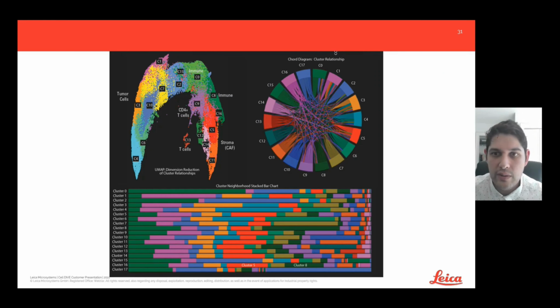This clustering data gives a clue as to why that might be. These desmoplastic cells in cluster 16 cluster often with clusters 5 and 8, and these represent smooth muscle actin positive stromal cells and CD45 immune cells, respectively. So what might be occurring in these tissues is that immune cells are getting bound up in collagen networks, and a hardening of the tissue might be preventing further entry.